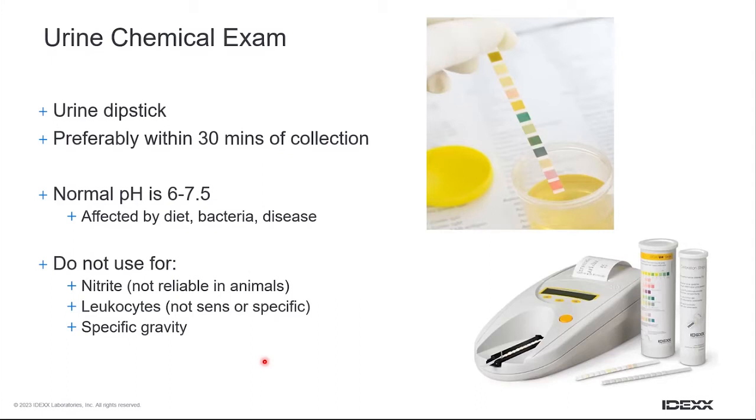If you're relying on a client bringing in a urine sample, that could mean the sample is lying overnight or several hours before that sample has been collected. And we'll explain the importance of rapid analysis of urine as we go through the rest of this presentation.